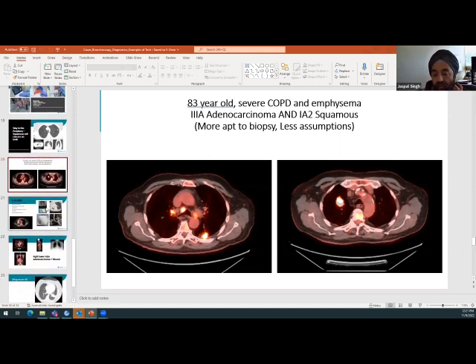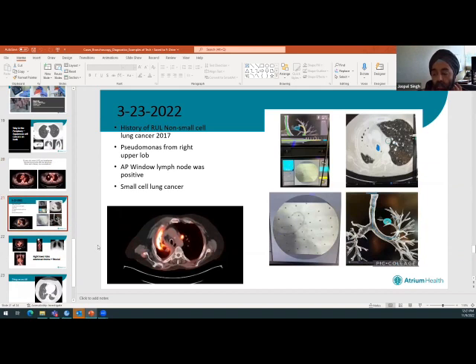And just last month, I presented this case nationally, where back in the day, this patient had prior lung cancer up here that was radiated. The oncologist was sure, and I was sure, that this was cancer recurrence. Sure enough, it wasn't. This was an infection causing that same look. But what is interesting is, see that little spot right there, the lymph node? That's right by a huge blood vessel. And back in the day, and actually even today, most places in the country would not biopsy that lesion because it's too hard to get to. It's in no man's land. It's a tough surgery. It's a tough, minimally invasive biopsy.